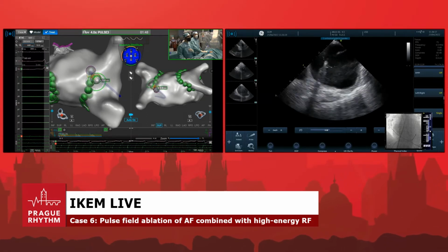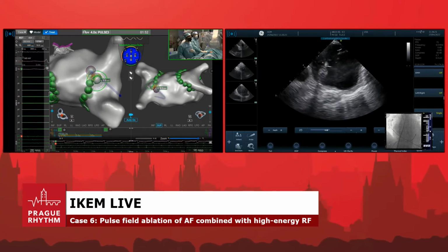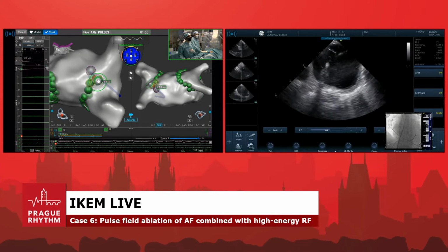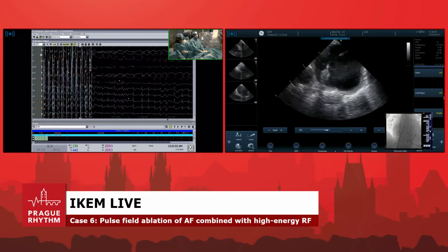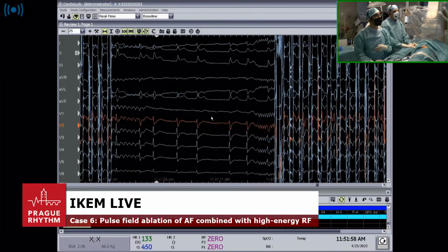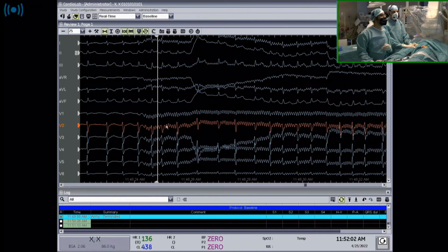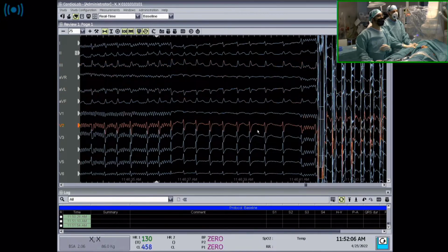Can we go to the left, to the review screen? Can you show us the review screen, to see what happened? Can you go to the start of the elevation? So it was a transient event. It took about 4 minutes with no clear cue.